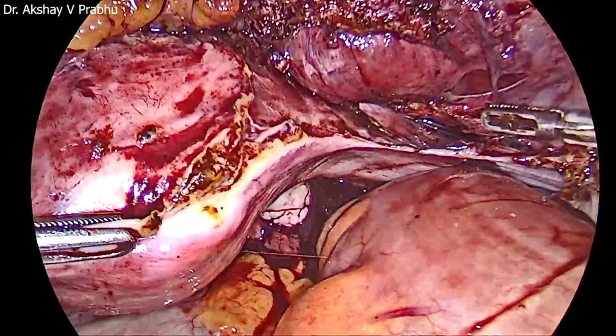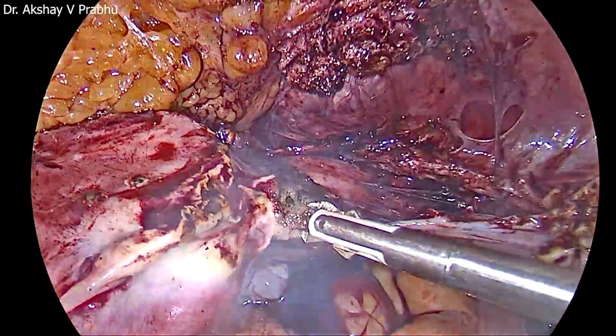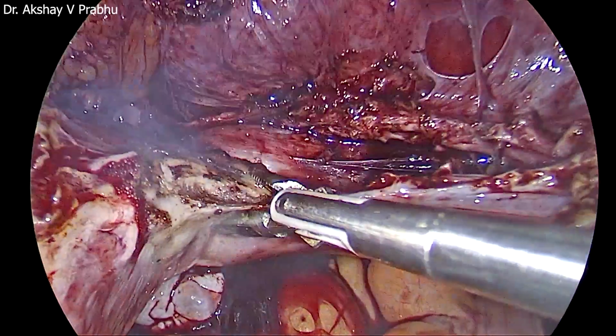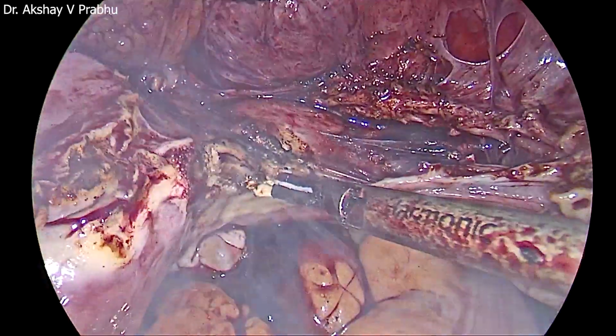Cardinal ligament and the collaterals of the uterine. Now the right side is very clear, more clear than the left side. You can see the junction between the cervix and the uterus where the uterine will be hiding. You can just cauterize it and then cut it with the harmonic scalpel. And with this, the entire adhesions are removed.